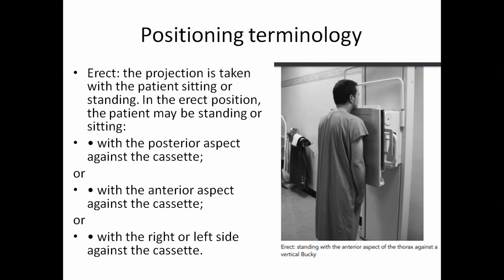First we'll take erect. The erect is the projection taken with the patient in a sitting or standing position. Most of the time when it says erect, most technologists think that the patient will be standing. No, we can take it with the patient sitting also. That is called an erect positioning. If the patient is comfortable, then only we will ask the patient to stand.